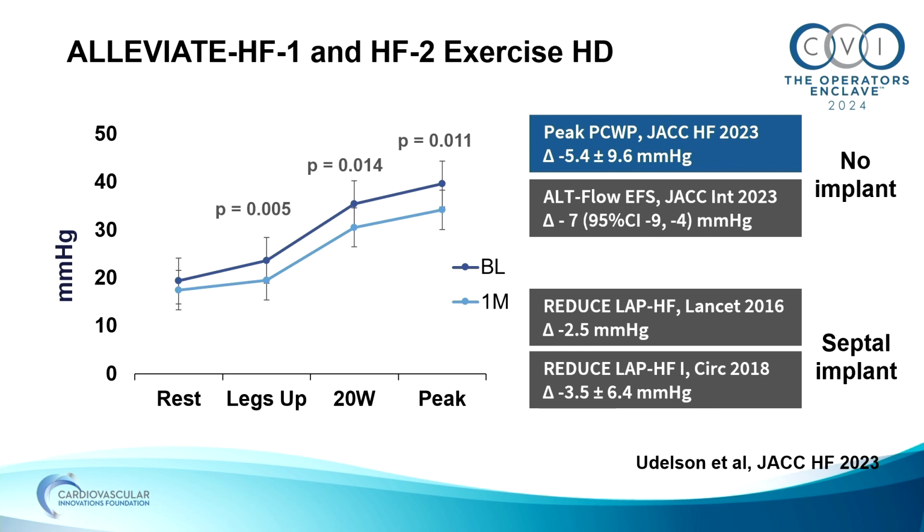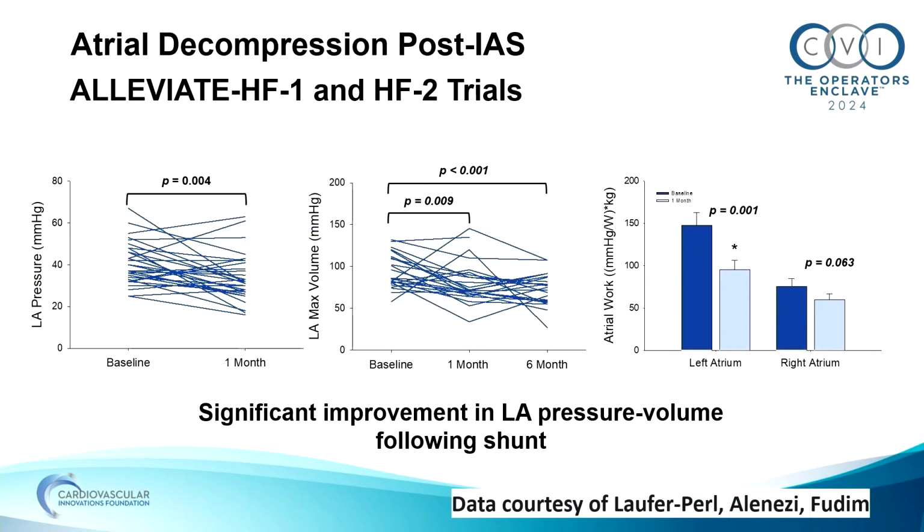How does that play out, or does it play out into any clinical effects? We don't know at this stage. Time will tell. These are some data that were put together, not published, by Murat Fudim and his colleague at Duke, along with Miguel Lofer-Pearl in Israel. And these are the echo data from the Alleviate HF 1 and 2 trials.